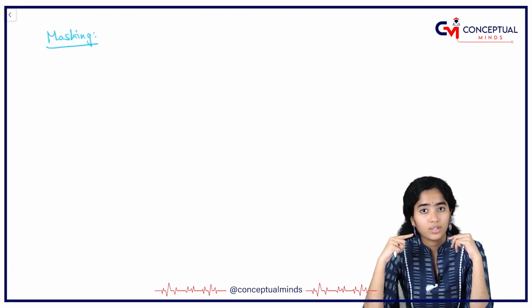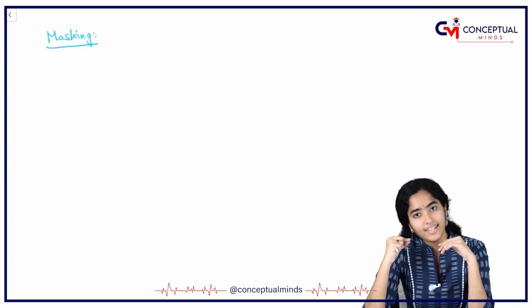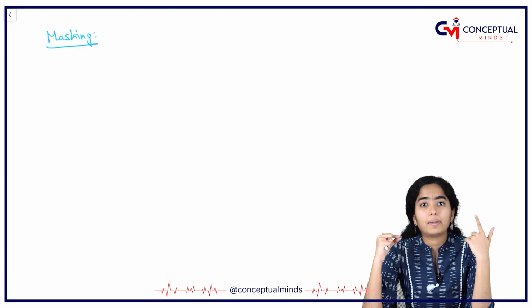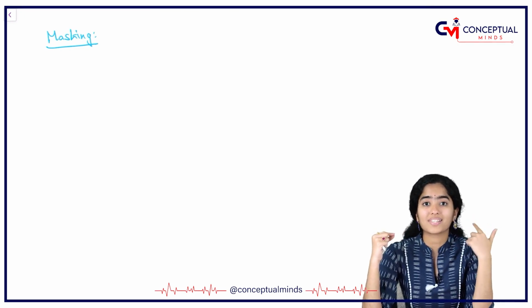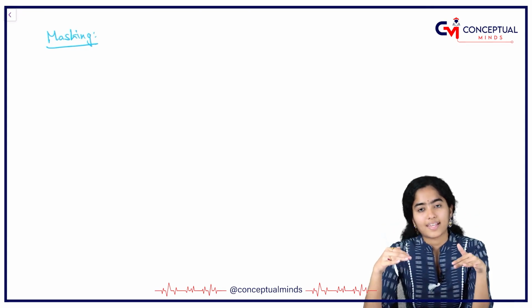And the patient will falsely say, I am able to hear at 60 decibels in the right ear. Although the hearing loss in the right ear is 80 decibels, which you have found out by some other mechanism, at 60 itself the patient will say, I am able to hear. Why? Because the opposite side ear is responding to that sound. Or I'll give you another example.